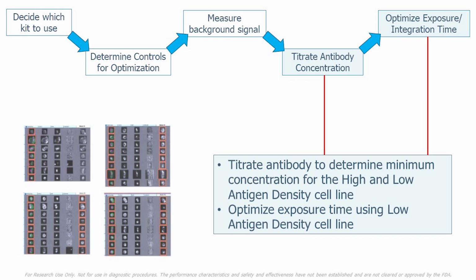Then, optimize your exposure time using the low antigen density cell line. You don't need to focus too much on the images here. They're just an example of outputs from the CellSearch cell browser as you optimize your exposure time.